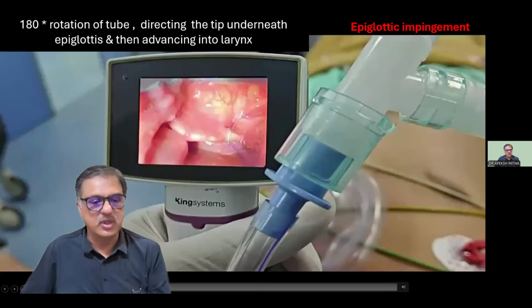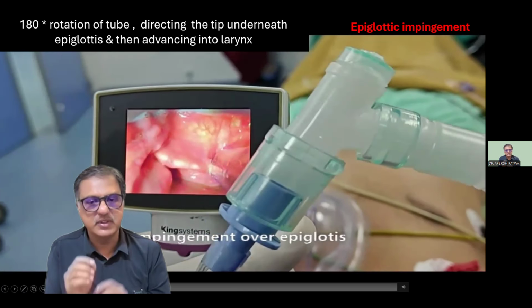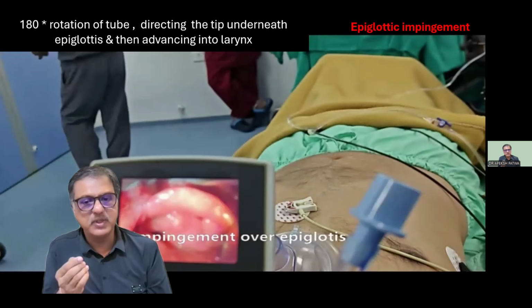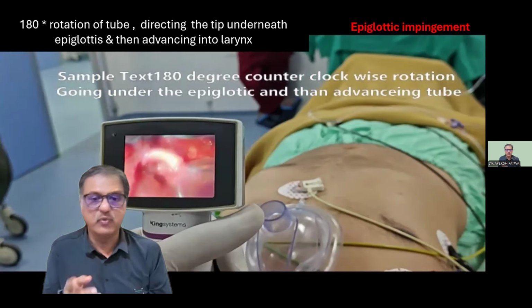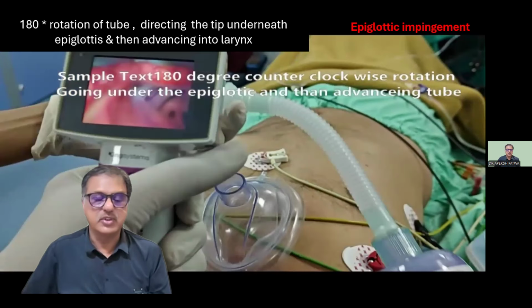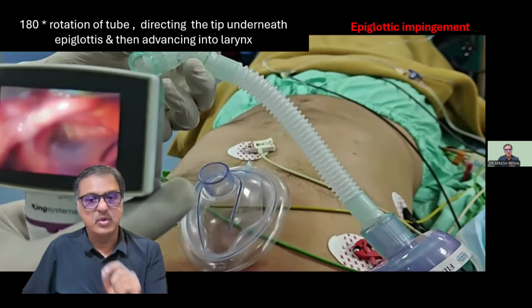This is a tricky situation. When your tube is getting impinged at the epiglottis with the channel blade, what you have to do is withdraw the tube a little bit and rotate the endotracheal tube 180 degrees inside the channel, get underneath the epiglottis, then re-rotate and advance the tube. It's the trickiest impingement to overcome.